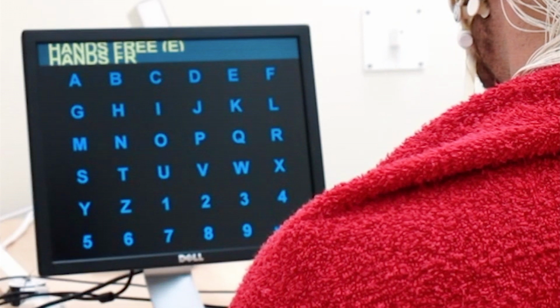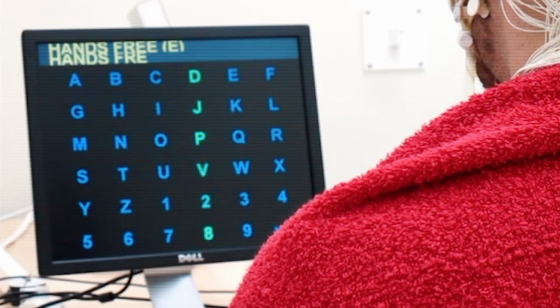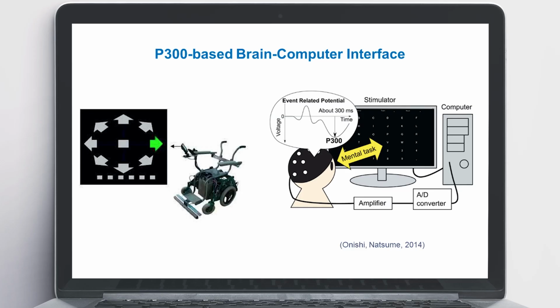If the participant stays focused on the task and is not distracted, P300 appears each time the desired letter is lit up, and the interface, using the intersection of rows and columns, finds the letter and enters it into the field. Typing is quite fast when the classifier is correctly set up. This technology is crucial for those with disabilities who are unable to move freely or have limited vocal capability. For example, this technology is used in the communication system NeuroChat.